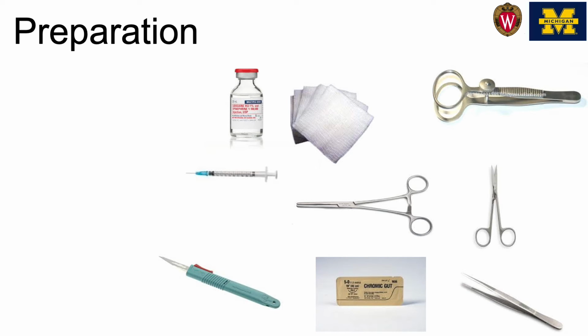I have our clinic assemble all of these things into a kit, packaged in a biohazard bag, along with a formalin jar so that I can put the specimen in the formalin for pathology.